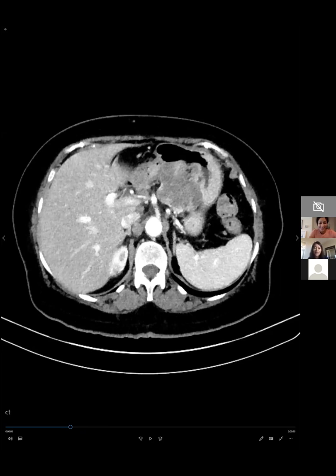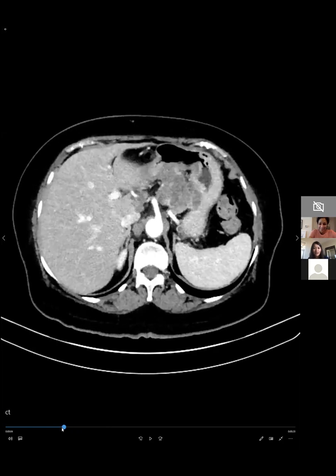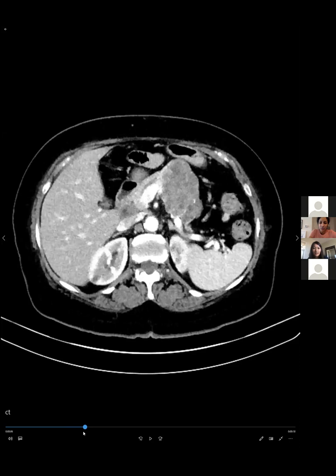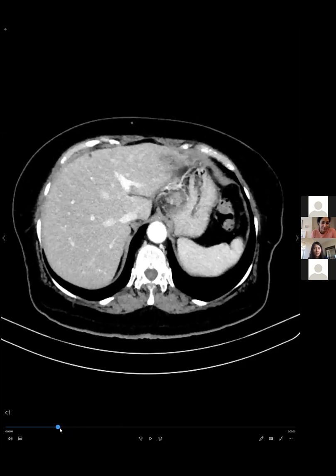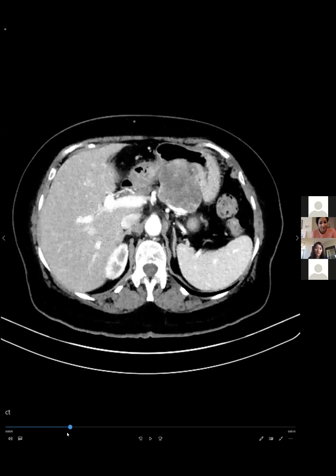Can you keep scrolling? I'm looking at the stomach, and I'm just not comfortable with the stomach. There's an ulcerating thingy right there. Is that true invasion, or is it just abutting both the vascular structures and the stomach? So Nelly's saying she would go for an endoscopic biopsy or something, right? Anything else you can do? And there's also nodal metastasis in the portohepatis. Right there. Yeah. So there was a node over there. Yeah, or anterior to the portal caval region.